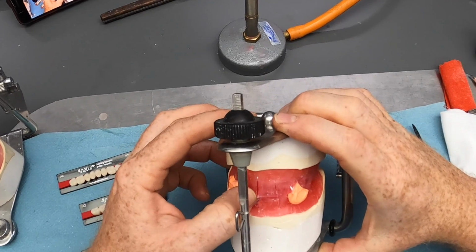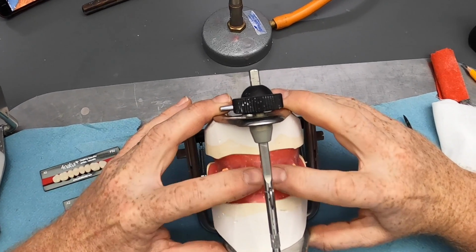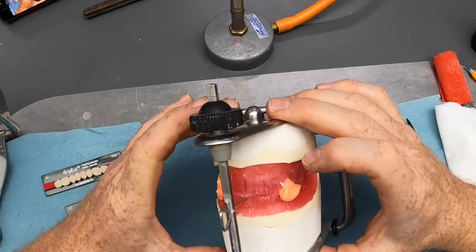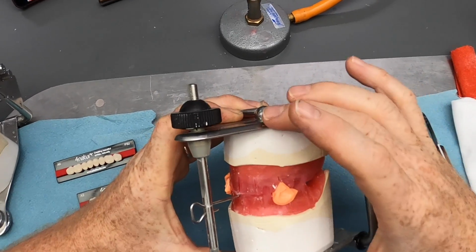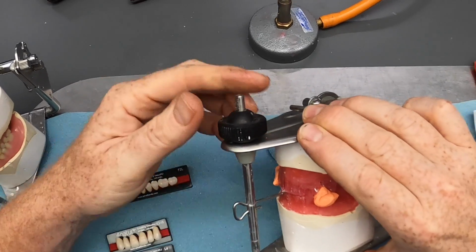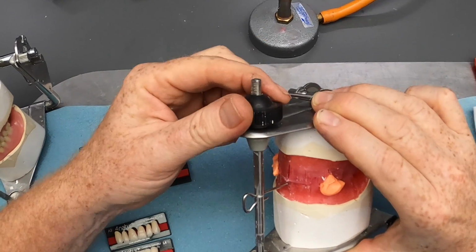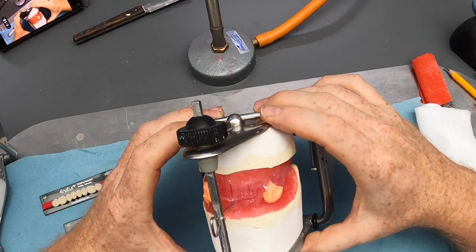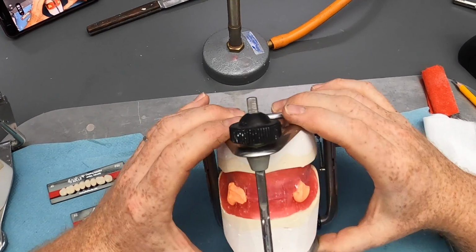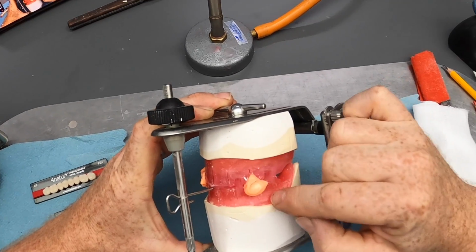Obviously the midline, which has been scribed on, so we can use that to position the 2 centrals and work around from there. And then we've got the vertical dimension that's been established, so that's locked now into position, and we make sure that this pin here, the incisal pin on the articulator, stays at its 0 point. And then finally, of course, we've got the upper and lower related to each other in centric relation.